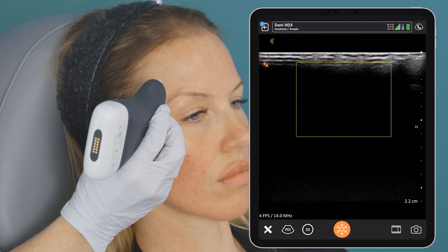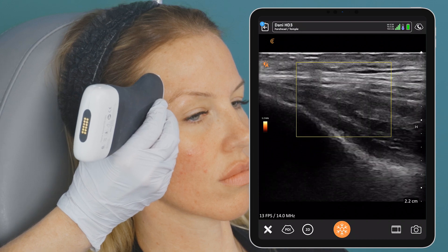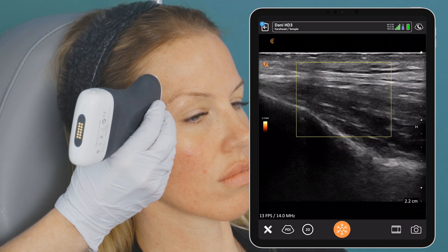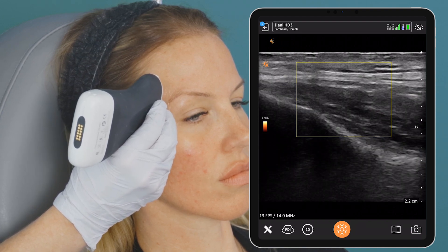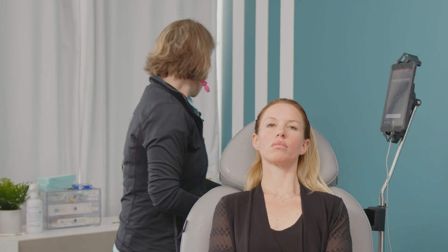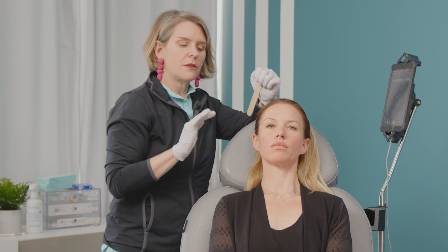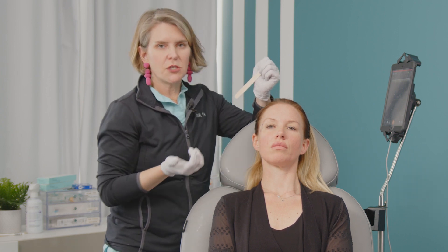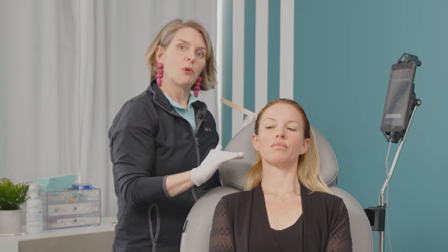Now, did we see any vessels along this path? We lucked out because looking at the screen, we're really not seeing vessels. This is a great moment to ask yourself: do you need to find the superficial temporal artery or the deep temporal artery to do this injection? We do not, because we're going to use a cannula and we're plotting out our course in this very thin, narrow strip. We don't see those vessels in this path, and that's okay — this is not where we need to find those vessels. If we did see them, we'd just be cognizant of where they are and go above or below them in layer two or layer four.